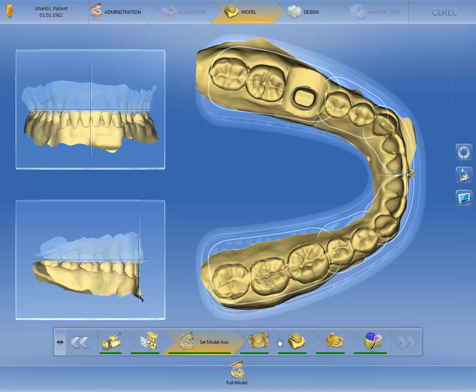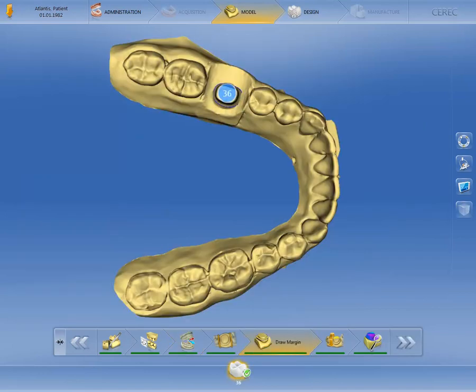In the model phase, we check and, if required, correct the settings of the model axes and move on to the draw margin step. The margin line was automatically transmitted with the Core File, and we turn our attention to the patient individual Atlantis abutment, which cannot be manipulated in the CEREC software.